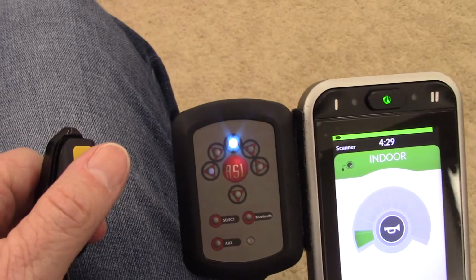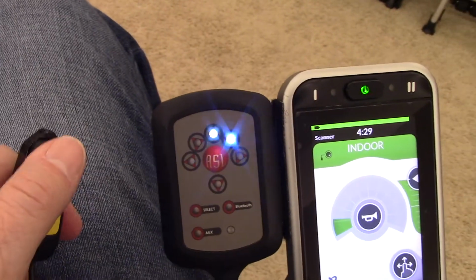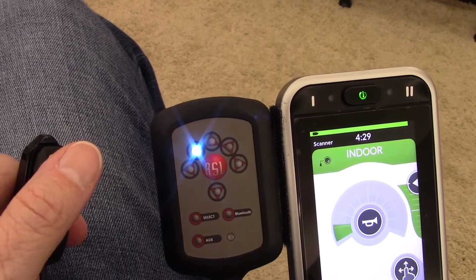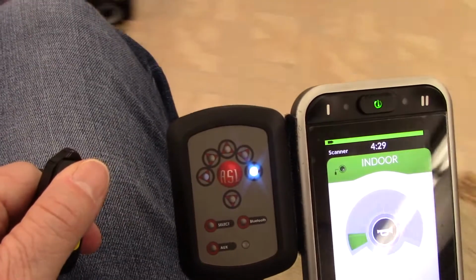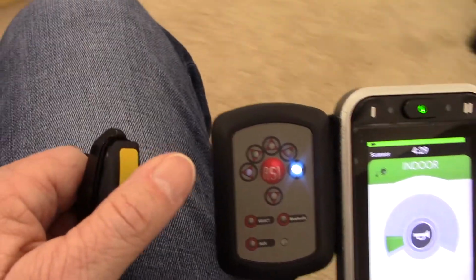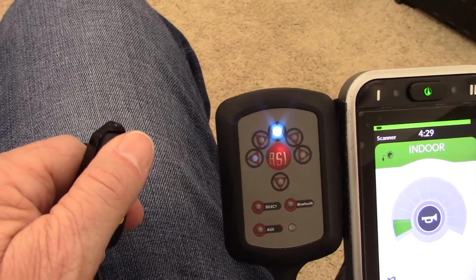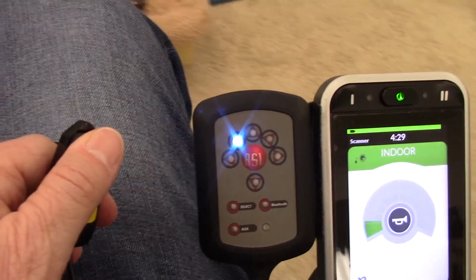Now I'm going to veer. There's a little veer. There's a little more. There's some forward. Right? I'm going to make a sharp right turn. You can see me swivel all the way around. Right? There's forward immediately, following any selection I make. There's to the left.